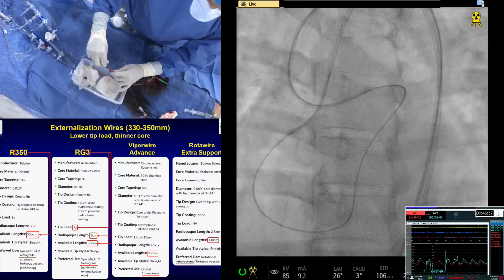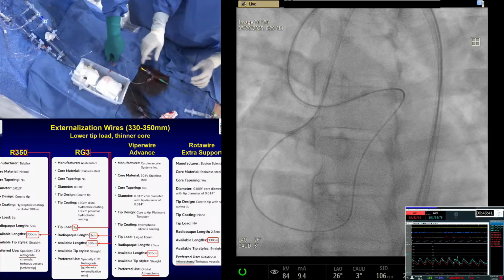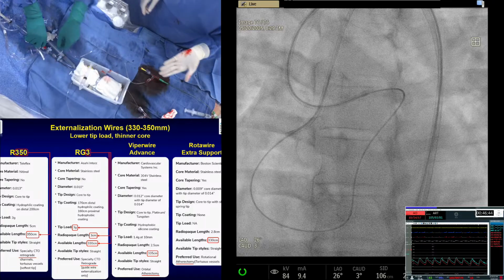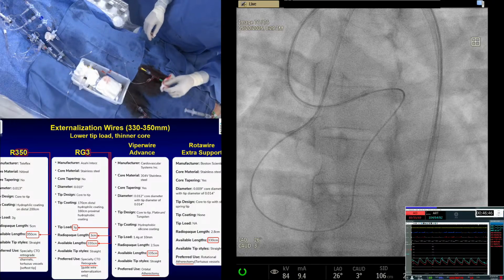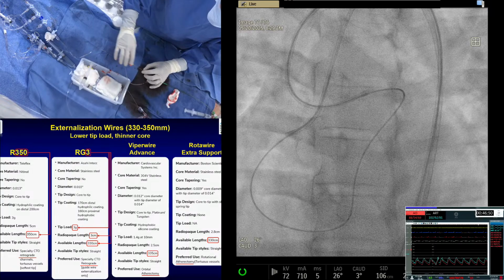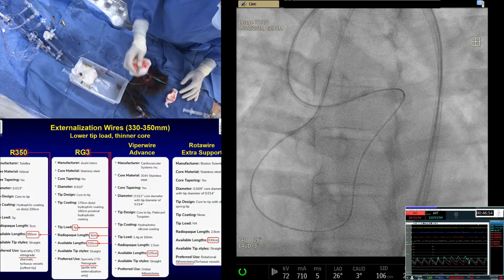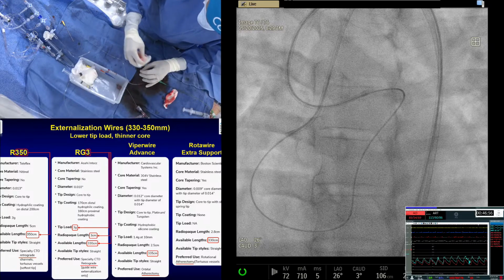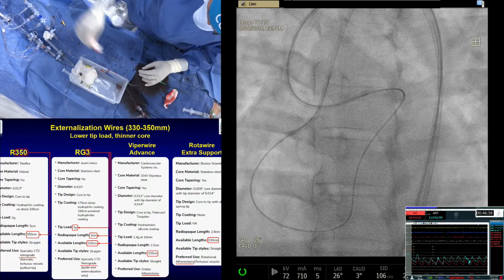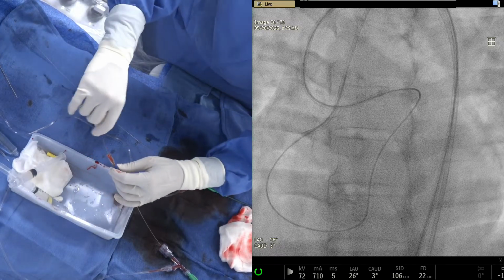Okay, now the wire has come out, and what is the step now? Can you show it on the camera? They're showing it, but you can't see it enough. Take the slides away now. Let's show the hands movement a little more. Magnify that because that's more important. The slides have been shown now. Good. So show what it is now.